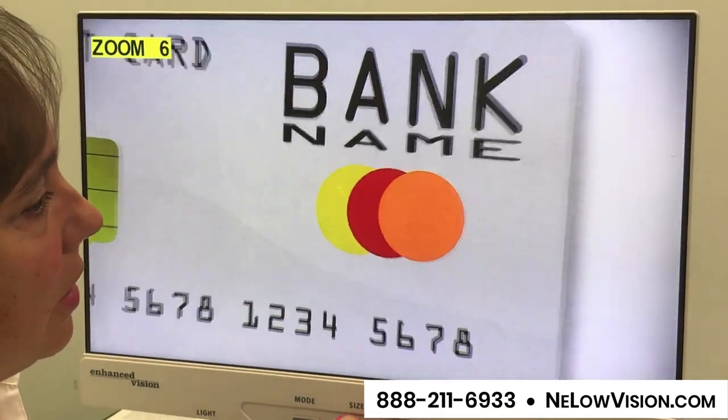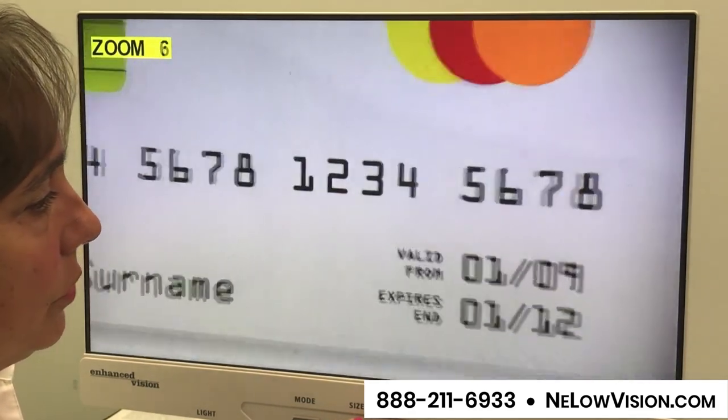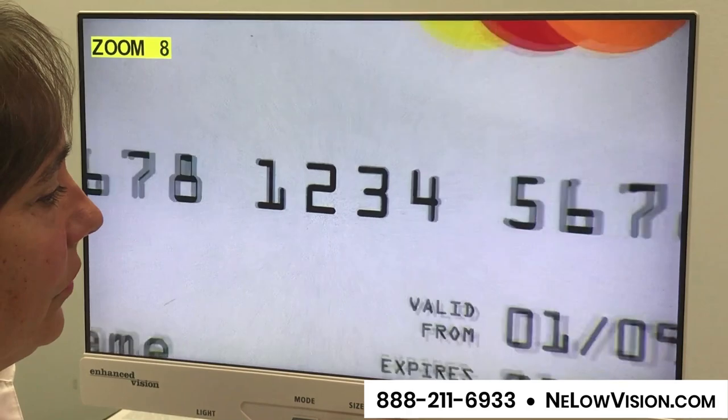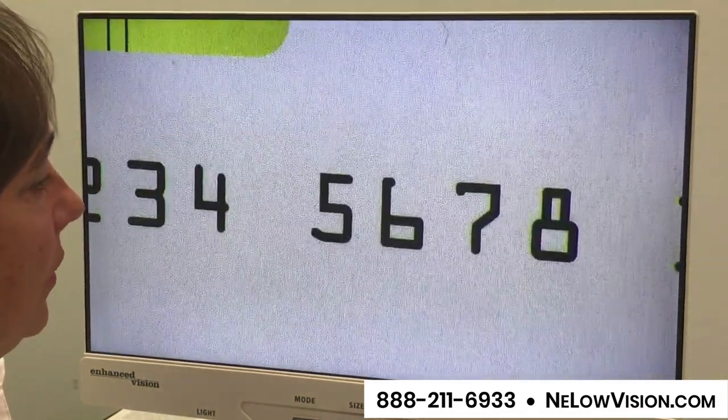Here's an example of a credit card and you can get right in on those numbers. So if you're doing some online shopping or credit card purchases, you can get in there and see the numbers comfortably — your expiration date, all that you need.